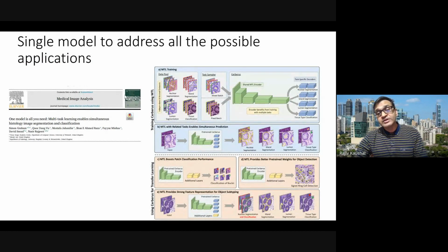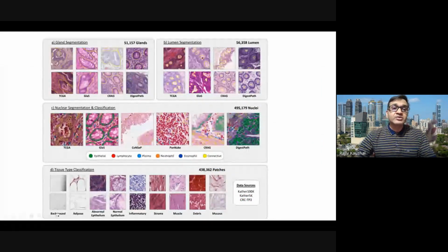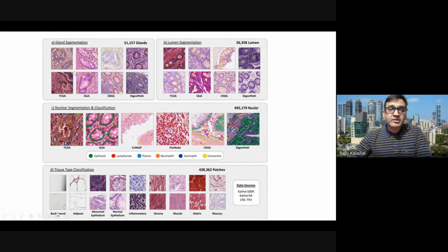And now, using these applications in more depth, there is a push to make a common AI-based model which can look at gland segmentation, meaning gland configuration, and even nuclear segmentation, because as we know, in colonic cancers we can see necrosis or secretions.